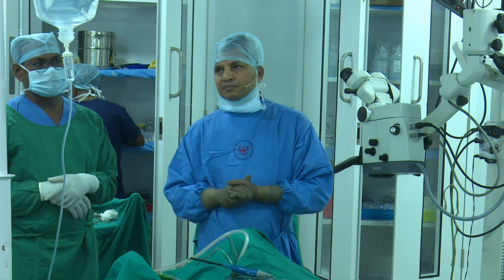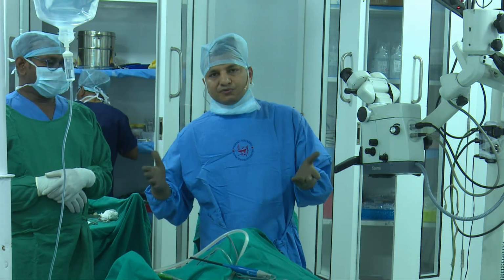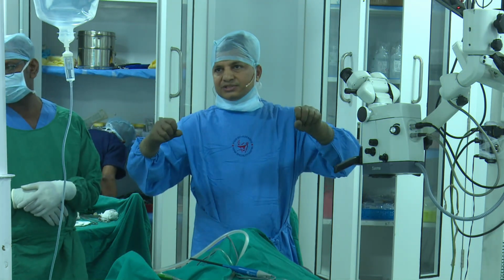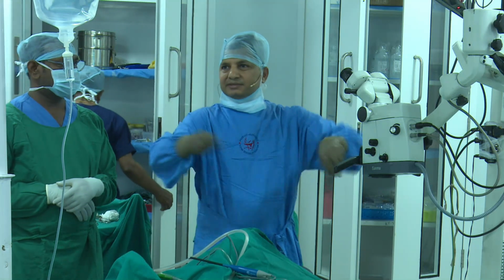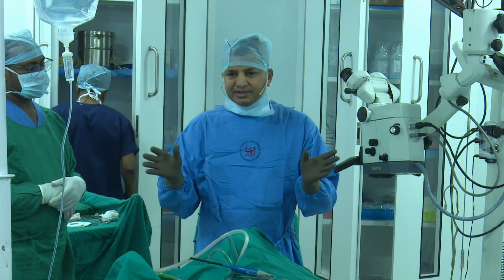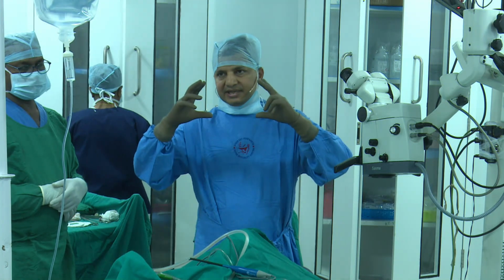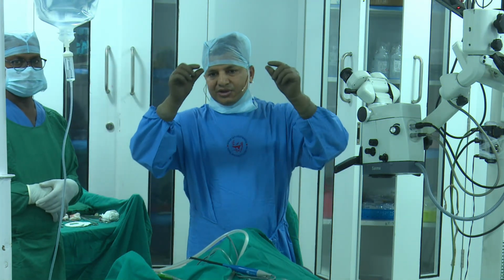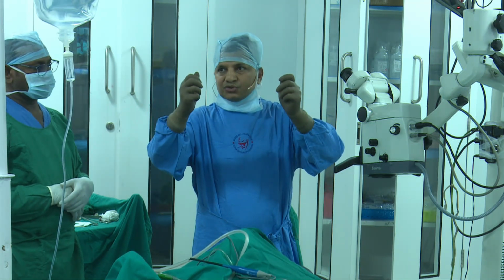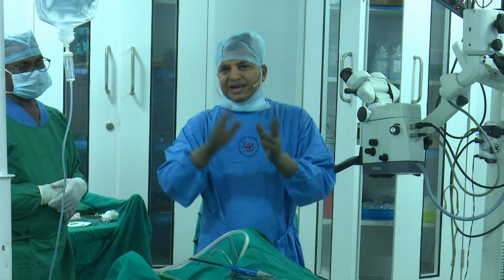The directional healing vector in this particular part, is it more on a narrowing level or does it open up more superolaterally? Yeah, so why I started using barbed suture, first of all, because earlier I was removing the part of the posterior pillar along with the tonsil. The surgery was very quick, 15 minutes UPPP was over. And healing was also pretty fast, no question of any wound dehiscence or suture falling, nothing. But the healing of the posterior pillar used to pull the soft palate a little posteriorly. So my retropalatal space would reduce by a few millimeters, and that would impact the results.